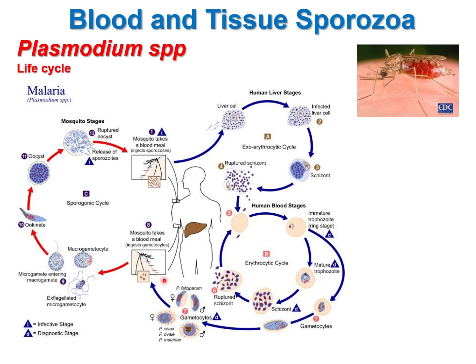Some of the trophozoite stages will transform into gametocytes in our blood, and the Anopheles, upon taking a new blood meal, will ingest these gametocytes. There are differences, and I will come later to them, but I want to draw your attention that for Plasmodium falciparum, gametocytes are crescentic, whereas for the 3 others, vivax, ovale, and malariae, they have an oval shape, and we cannot distinguish them under the microscope in a blood smear. So for these 3 species we have to look for other characteristics in order to identify them in a blood smear.